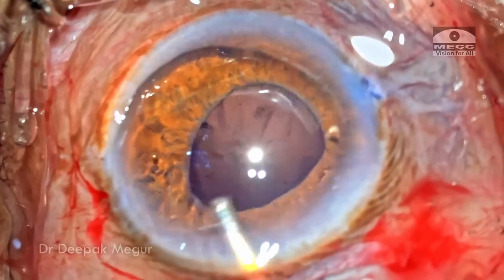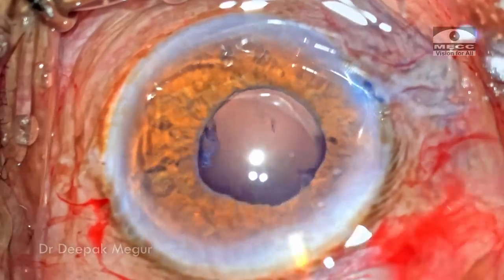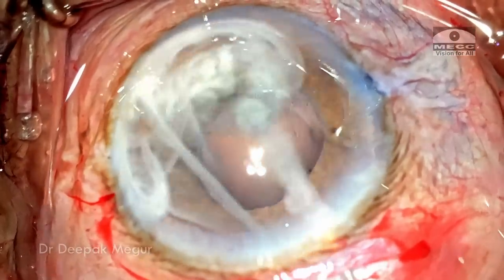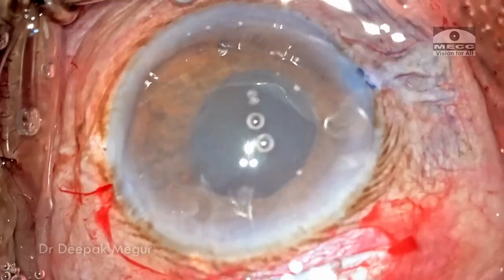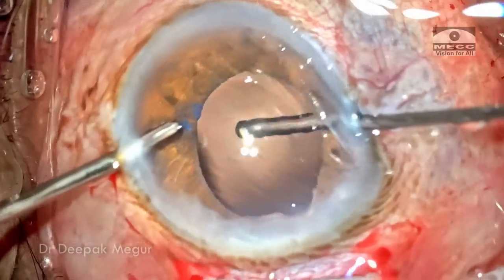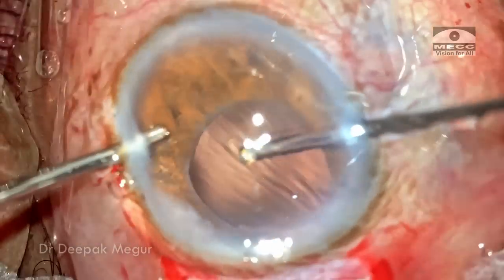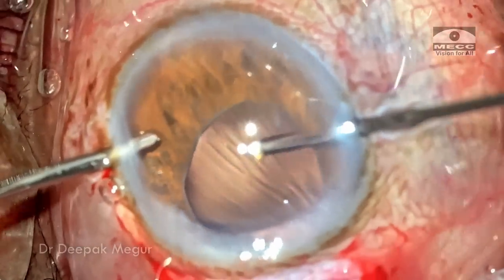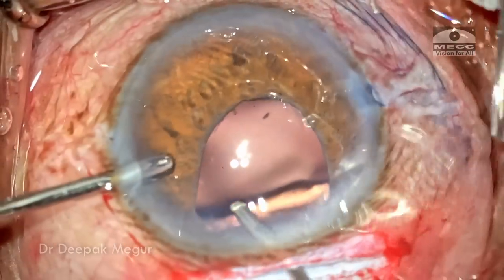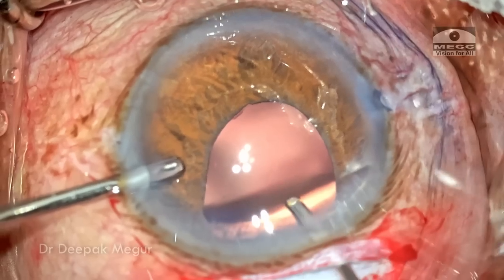So now we have an intracapsular extraction. Time to perform the anterior vitrectomy and then fix the lens. Diluted triamcinolone acetonide is used to stain any prolapsed vitreous. Bimanual anterior vitrectomy is being performed now. There are severe corneal folds and the eye is becoming a little bit soft as I'm maneuvering through the two side ports, so I changed my strategy and I'm going to enter through the main incision itself with the cutter.